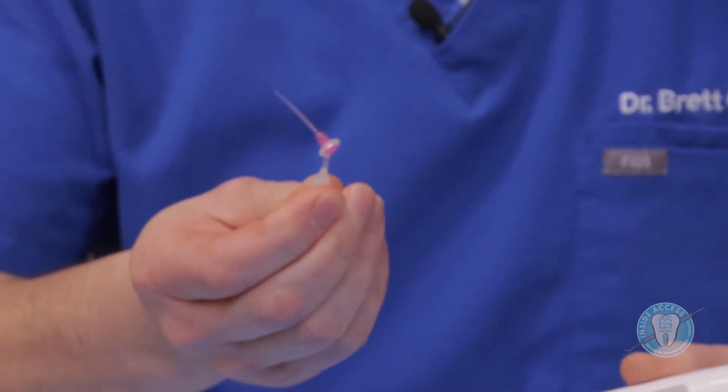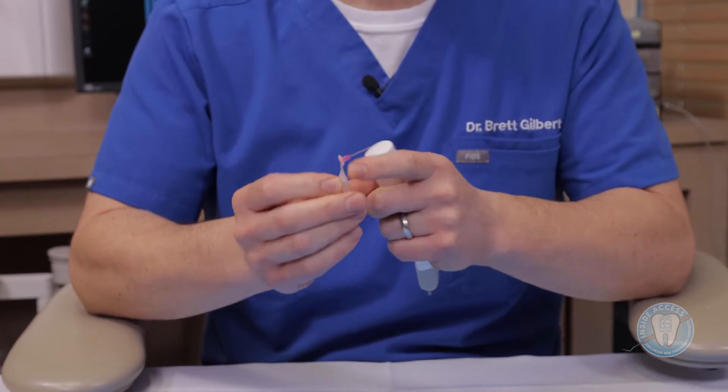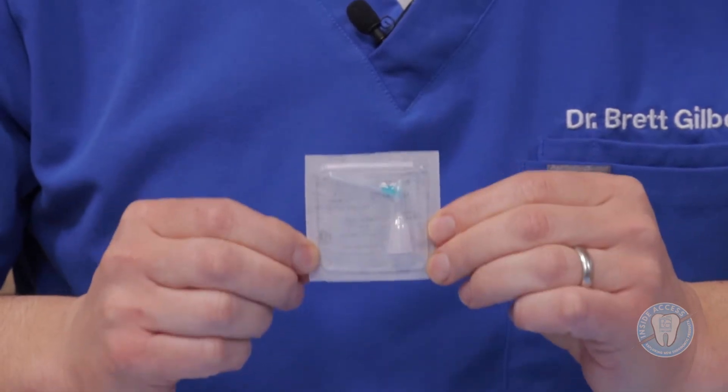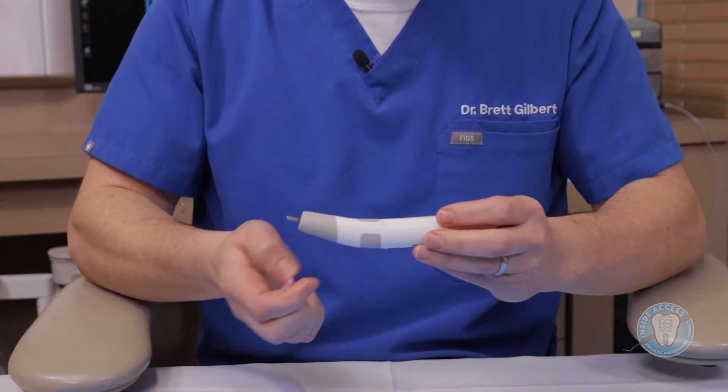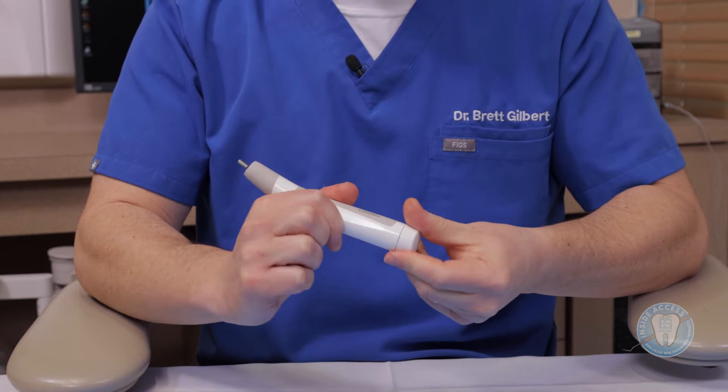First and foremost, it has these nice disposable tips that are color-coded as to their size. Just like in ISO color-coding, the white is going to be for a 15 at the tip, the red will be 25 at the tip, and the green 35 at the tip. So you have some versatility based upon the size of the canal preparations. This is the unit — it has just a double-A battery in there.